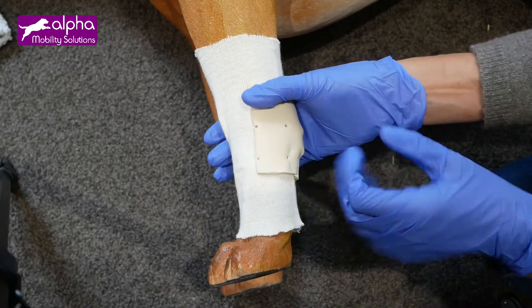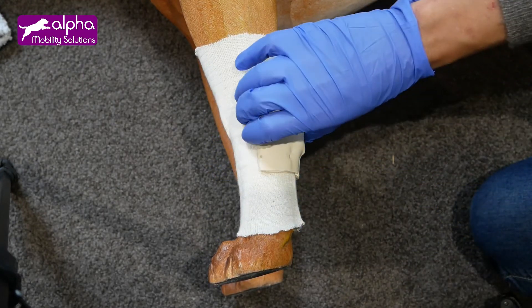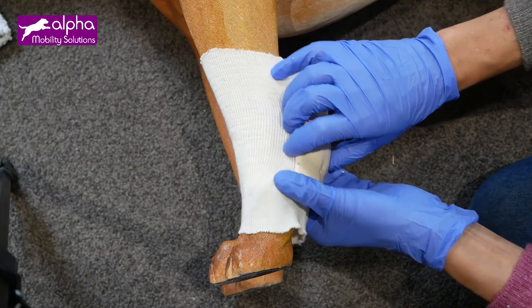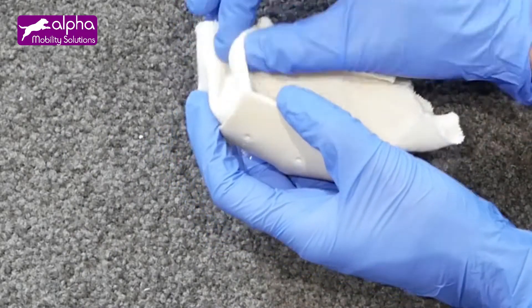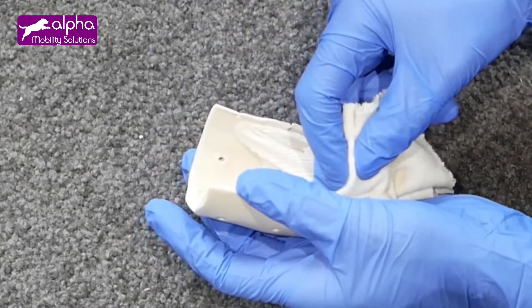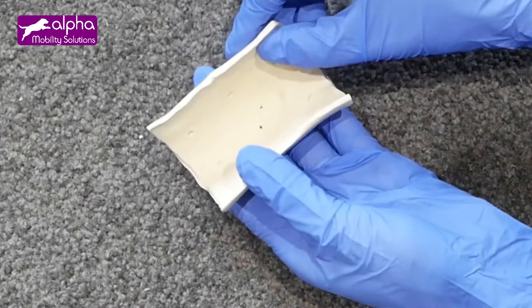Remove the splint gently. Sometimes the fabric may stick to it — gently remove it. As you can see, it is the exact contour and shape of the patient's leg.